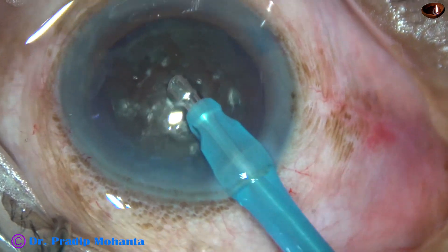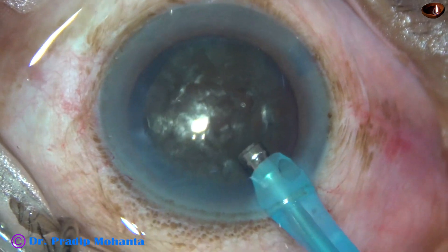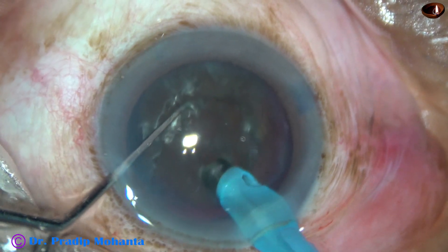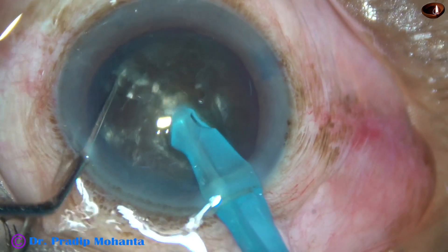Some superficial cortical lens matter is removed and then the handpiece is turned to make the bevel up. With the help of this chopper, the nucleus is pushed a little down and the tip is buried into the substance of the nucleus just in front of the main incision.